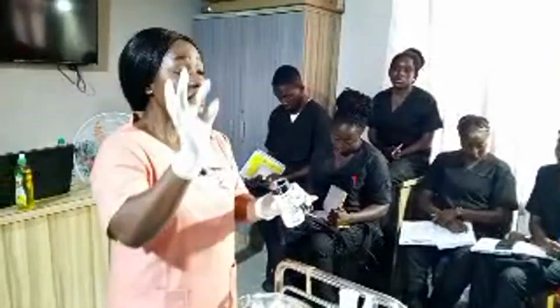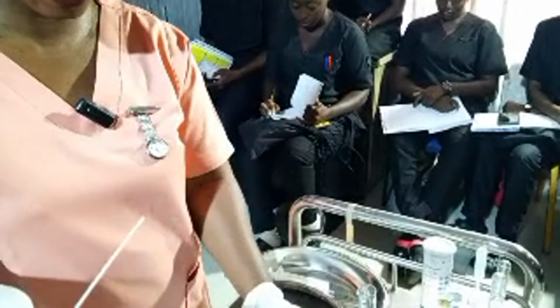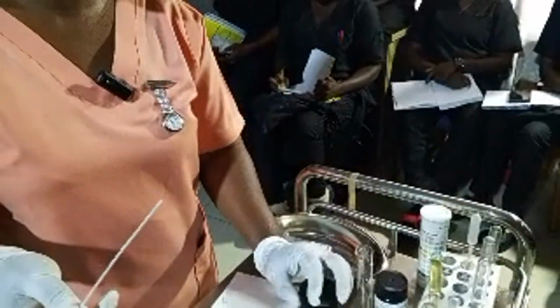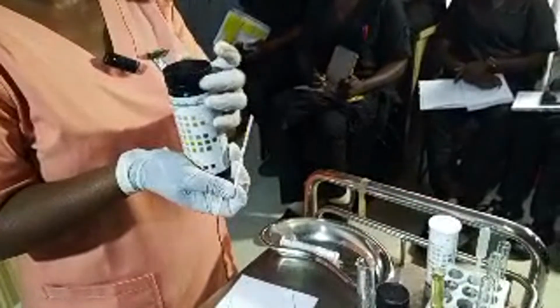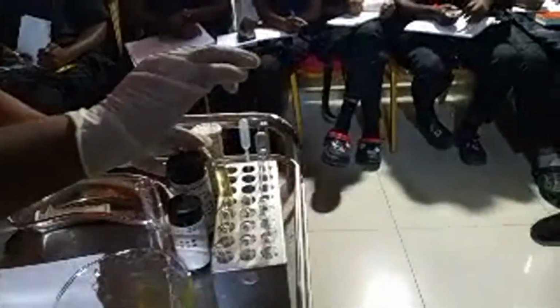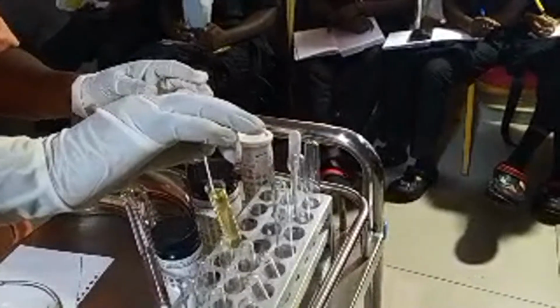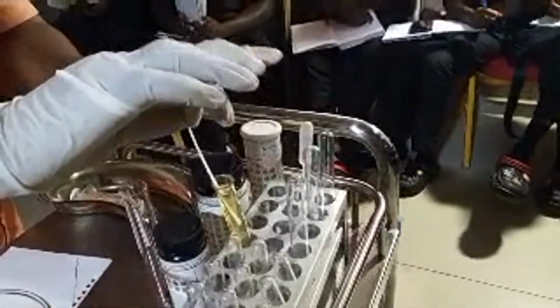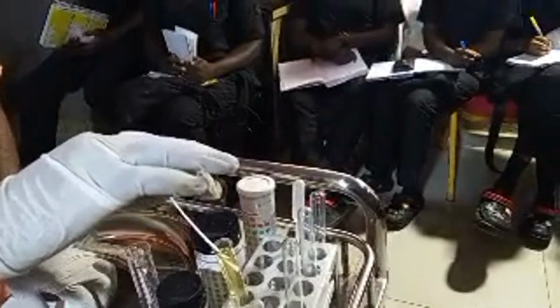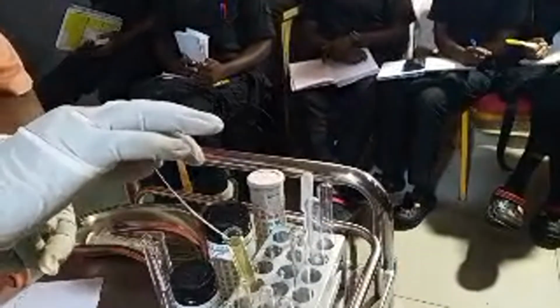So we can go with this strip. The next thing is for me to immediately remove one of the strips, close the container immediately, dip it inside the urine, and remove excess urine by rubbing it at the edge of the test tube, right?